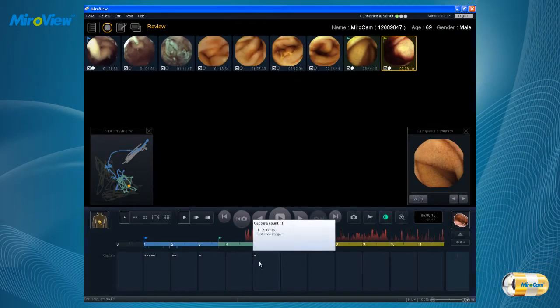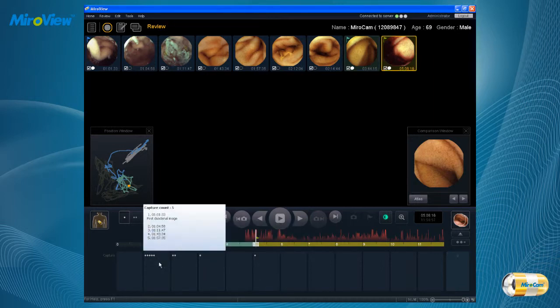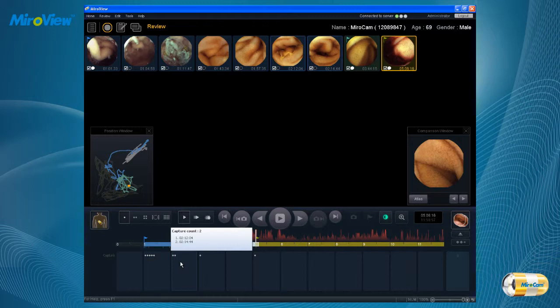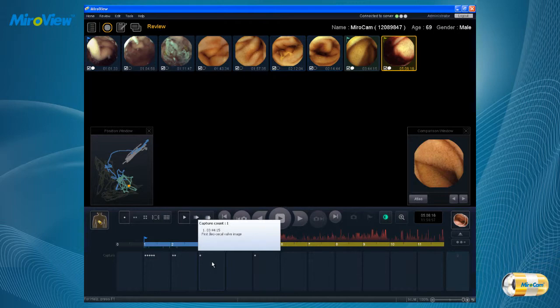The capture findings summary box will show captured images and the captured time to help determine the number of images over time or location, and to help identify the most problematic areas of the small bowel. Each image's pathology comments can also be automatically tabulated and divided into corresponding hours.